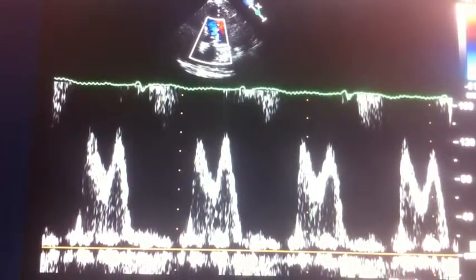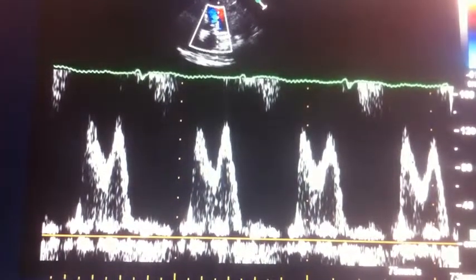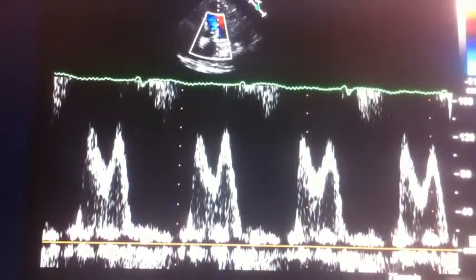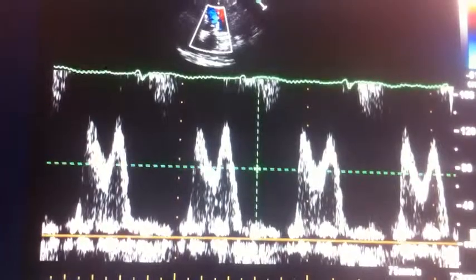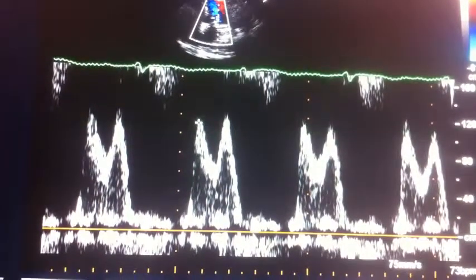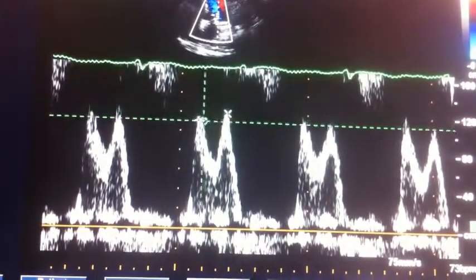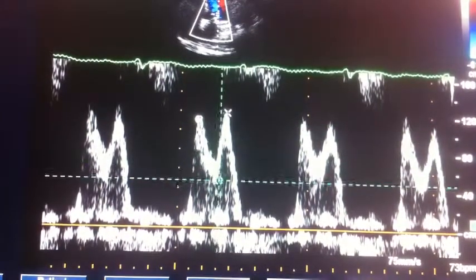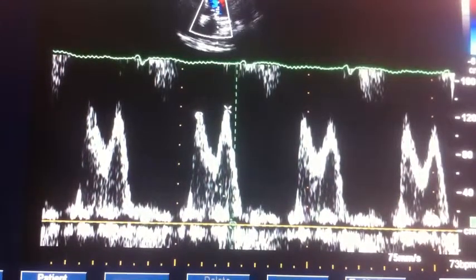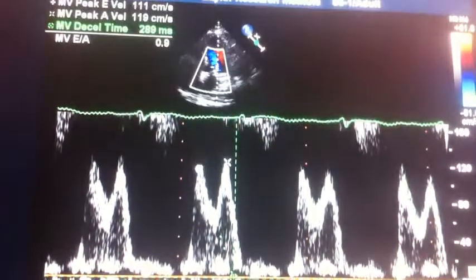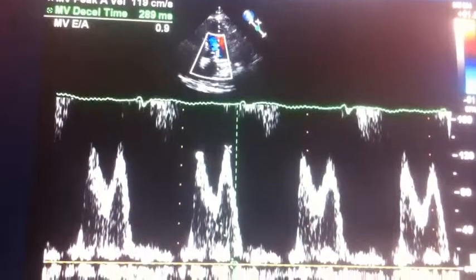This is another Doppler profile, through the mitral valve. Another measurement we can do is measure times and slopes. I can measure this peak E wave here and the peak A wave — just a couple of peaks. We can also measure the deceleration time: the time it takes for the slope of the first part of this profile to reach the baseline. The deceleration time for this patient was 289.